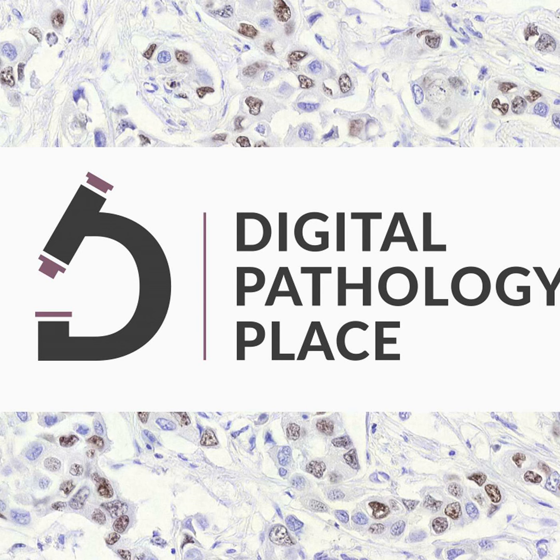Another place where we're starting to see some exciting work is in the immune response. There's multiple types of immune cells. There's multiple types of macrophages. And so just putting a single macrophage label into a tissue will tell you where the macrophages are, but it doesn't give you much more than that. And so there's a couple of papers out there now where, by identifying the different types of macrophages that are in liver, you can distinguish between different disease states, for example. Another interesting place is in breast right now. For a single breast panel, there's 4, 5, 6 biomarkers that are being used on different slices of tissue.